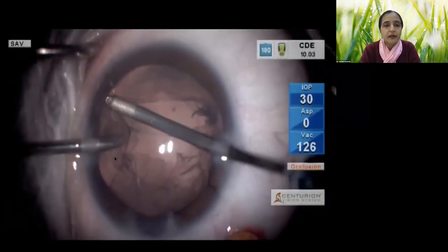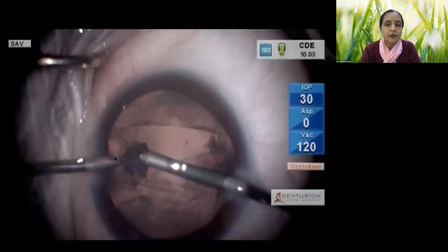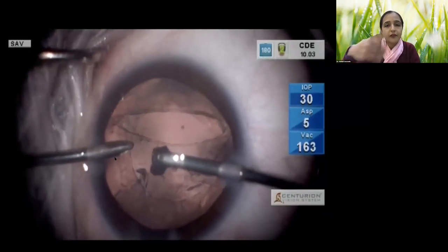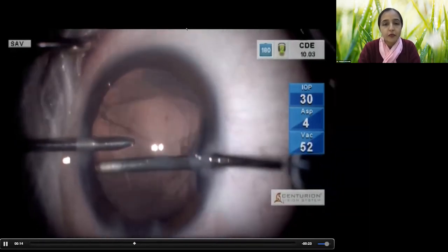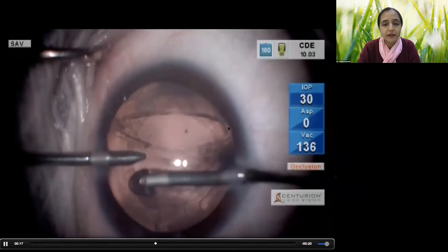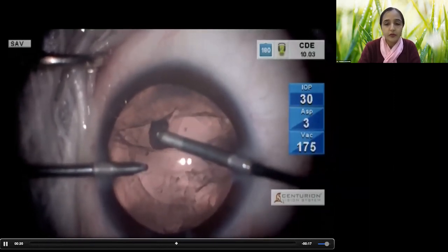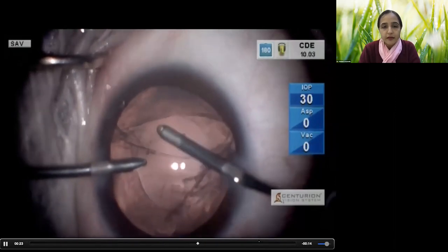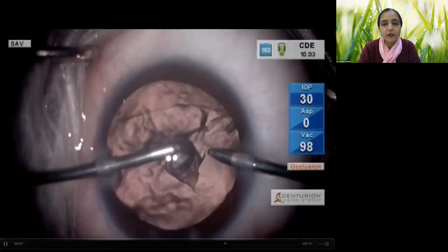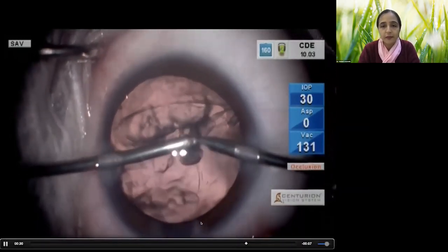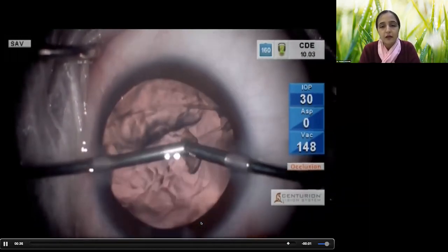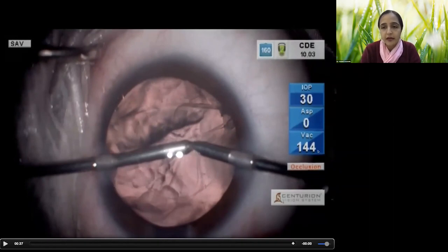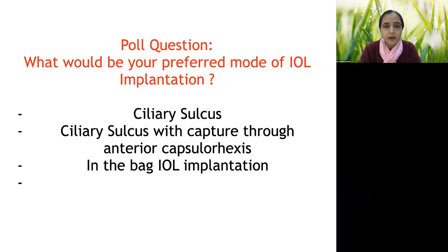Remove cortex starting from the area away from the PCR — so the cortex nearest the rupture is removed last. Keep irrigation in the middle of the eye to maintain a formed chamber. To work at modest vacuum of about 150 and avoid stressing the bag, I will mechanically feed cortex into the aspiration port. The irrigation is kept in the center and chamber collapse is avoided.